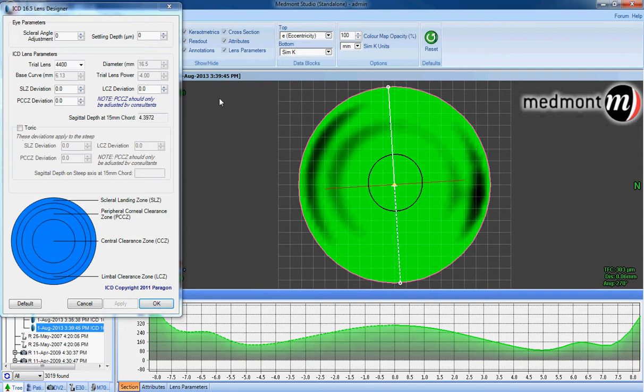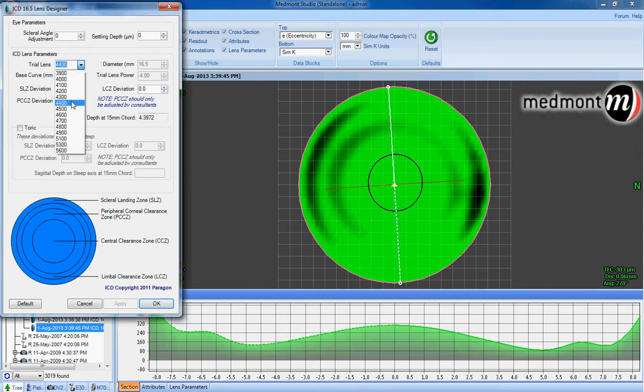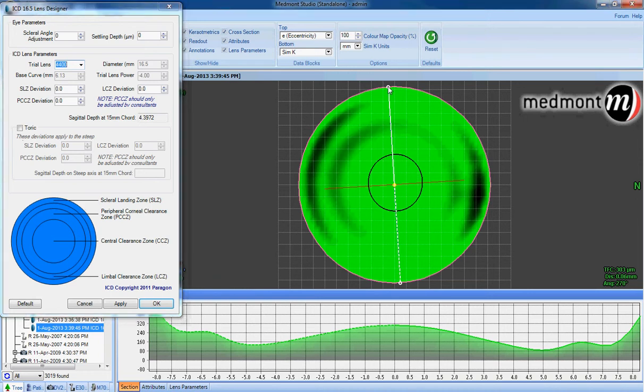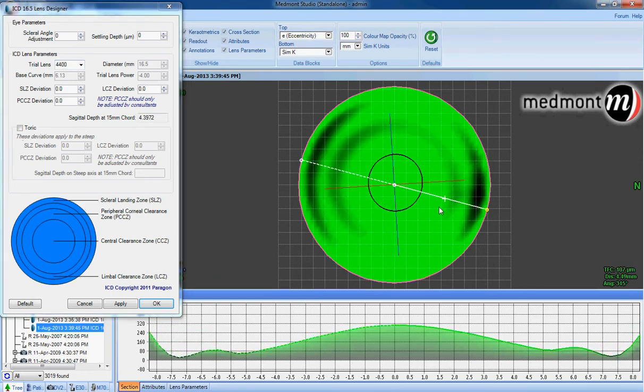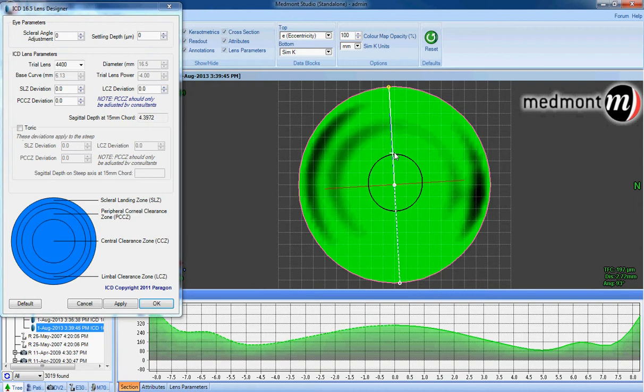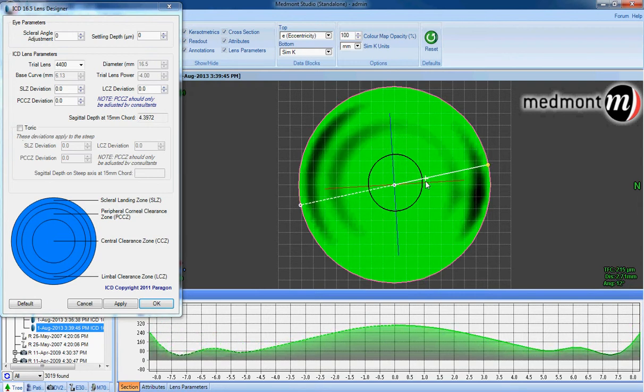If you desire more or less apical clearance, simply increase or decrease the sagittal depth of trial lens selected. Take the white axis line to the meridian of greatest bearing. Rotating this axis line around, look for the point on the graph where the lens appears to touch down on two opposing points.